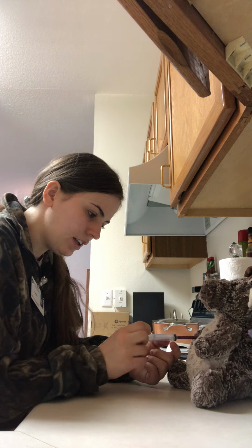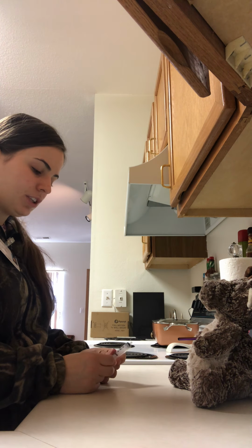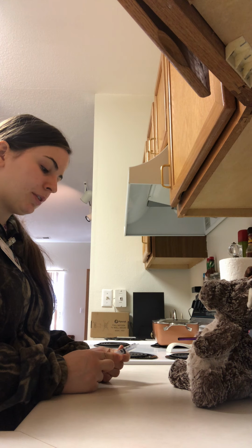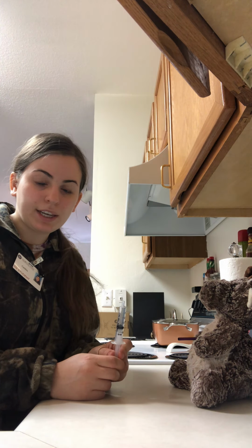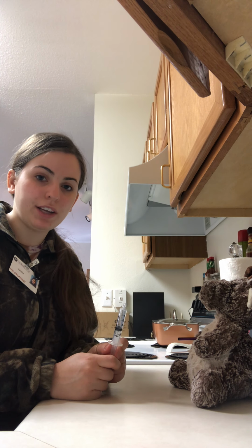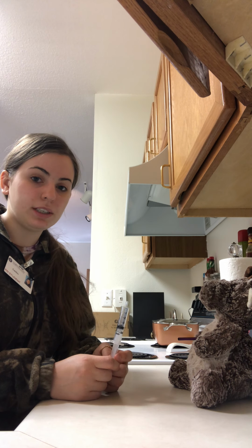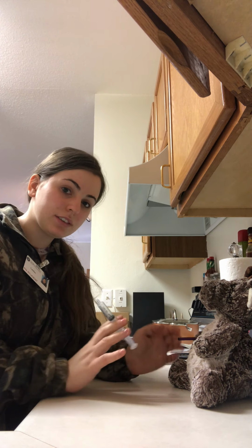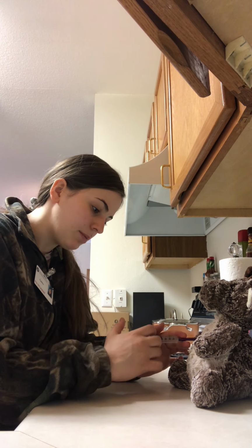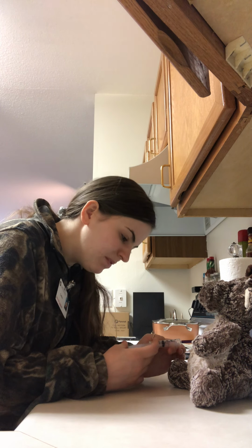Alright, then I would disconnect after I administered it. And then I would make sure to draw up 4 mL, which is the same amount of fluid as the dose of medication I just gave, and flush at the same rate. And also, when I looked in the drug book, it did not say that Lasix needed to be diluted. So I'm going to scrub the hub for 30 seconds, let it dry, and then I am going to flush over a minute and a half again with normal saline.